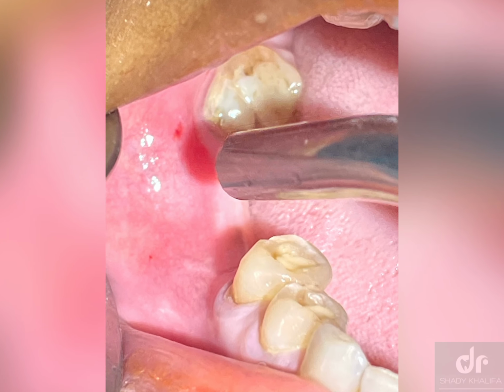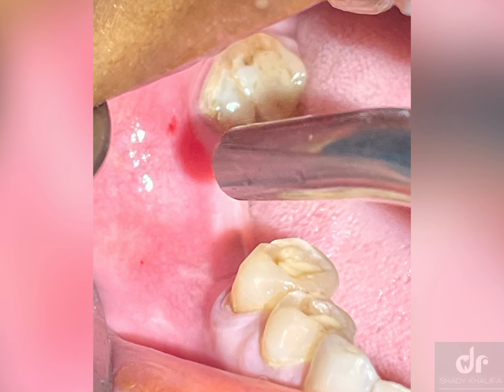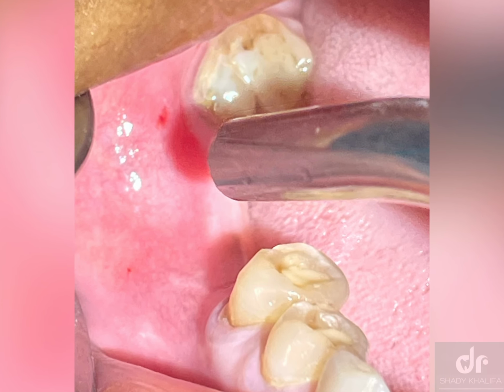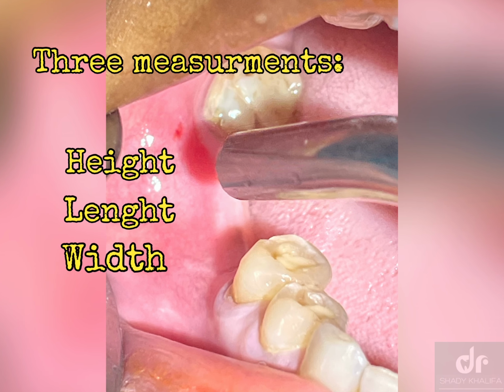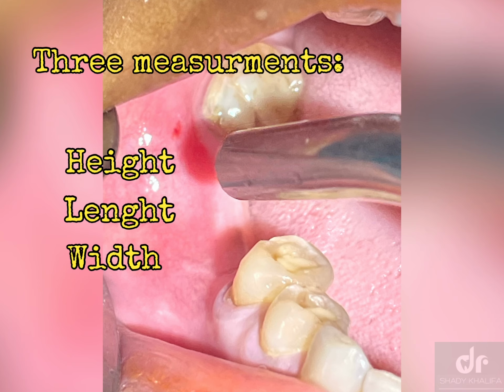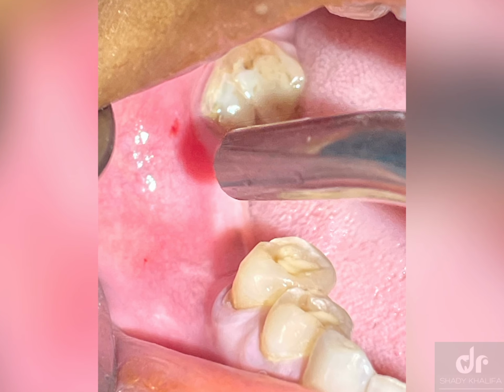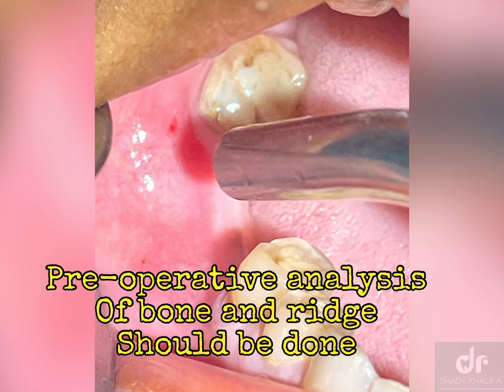We have to mention something that we should put in consideration: the difference between height, width, and length of the implant site. First of all, the height. The height is the distance measured from the crest of the bone downward apically, or in other words, from the coronal to the apical point.